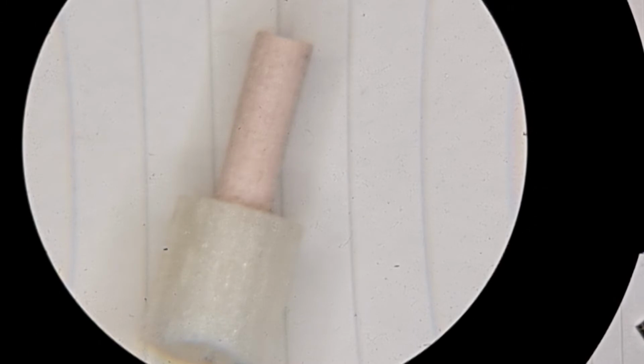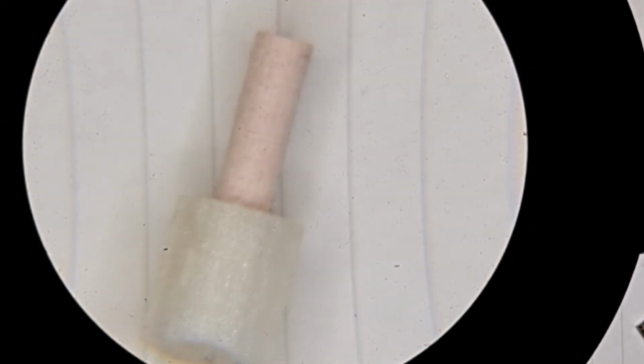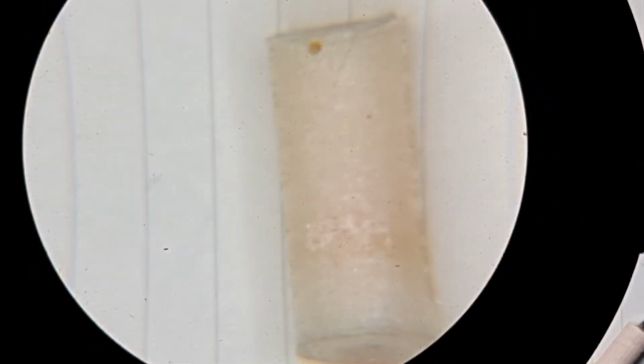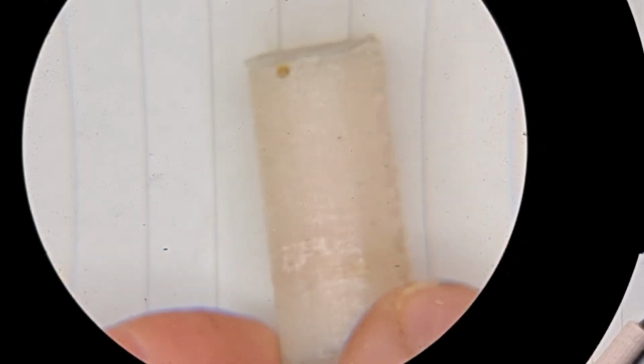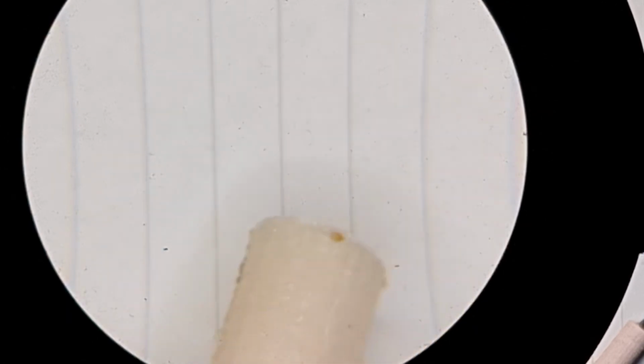And then after printing 90%, once this had set, I went back, heated the top of the whole print, and then restarted printing to seal off the unit itself, which is this one here, a finished unit. So you can see I had that on quite hot. I had that on 255 degrees, I think, because I wanted a good melt, because obviously visual excellence doesn't apply here. It's very much function and a little bit of form. So that's the sealed unit that I've actually used.